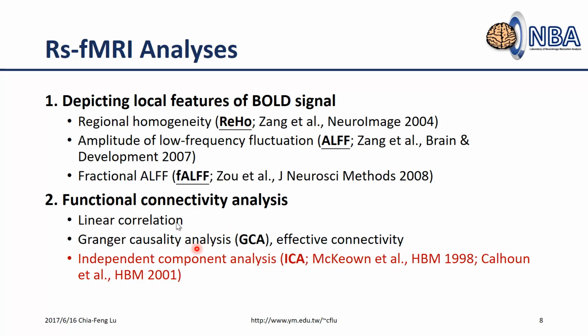So you need to understand that when we learn a new approach or a new method, you need to really understand what kind of scenario you can use this kind of analysis in. And the ICA is actually a pretty famous and historical method that was developed around 1990, and it was originally applied for signal analysis.